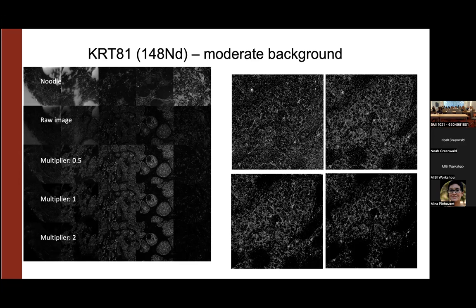Yeah, someone else actually had that exact question. How do you pick the representative FOV? I think that's key. Built into the process, it will randomly sample these images from all of the runs you've done, to make sure that the coefficients you get really are representative of your full cohort. And if there was a potential batch effect, that's maybe where it would pop up. But in general, I haven't seen a strong case where there's something super slide specific that would necessitate changing the coefficient just for that batch.